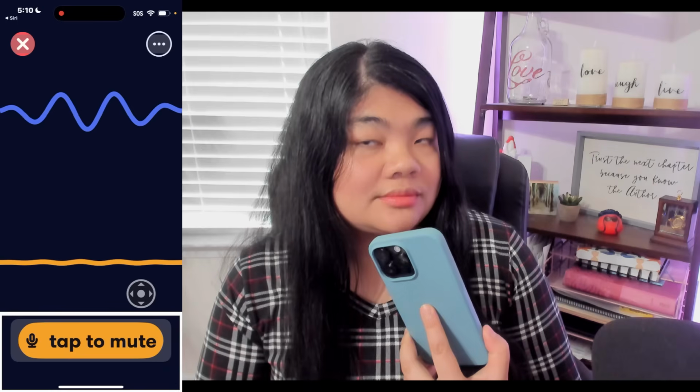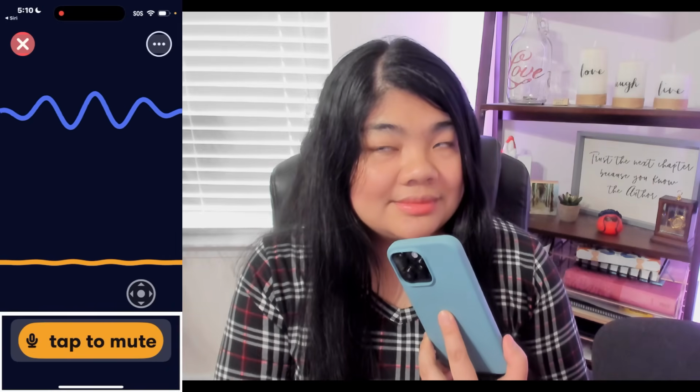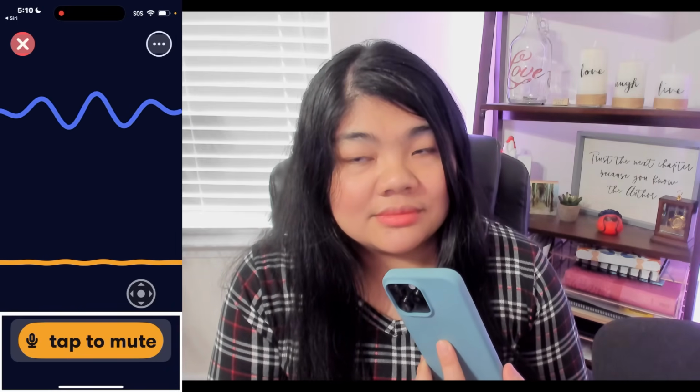Got it. I'll remember that you need to make a video about Envision Ally. If there's anything else, feel free to let me know.